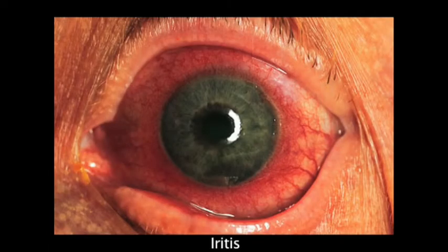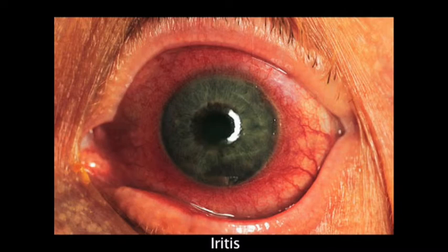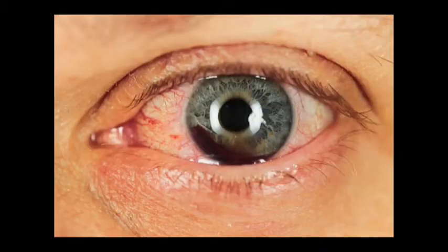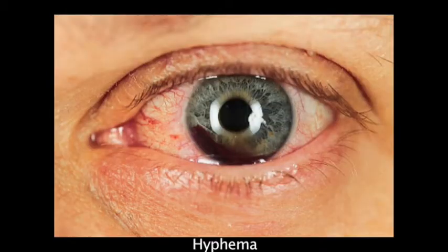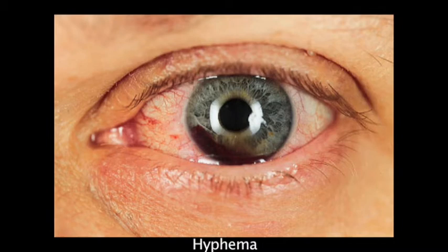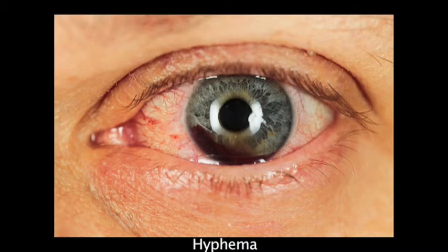This patient has iritis. Note the perilimbal injection of the conjunctiva, the mid-dilated pupil, and the cell and flare in the anterior chamber. These patients tend to have photophobia or light sensitivity. Traumatic iritis is common after a blunt injury to the eye. This is a hyphema caused by red blood cells in the anterior chamber. Traumatic injuries to the eye often produce hyphemas and are typically seen as a layering of blood cells in the anterior chamber. These blood cells can block the outflow of aqueous humor, leading to increased intraocular pressure. Patients with large hyphemas must be closely monitored for this development.